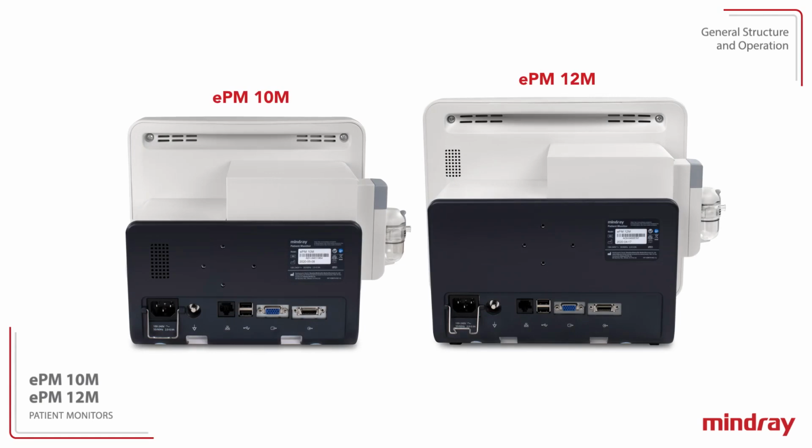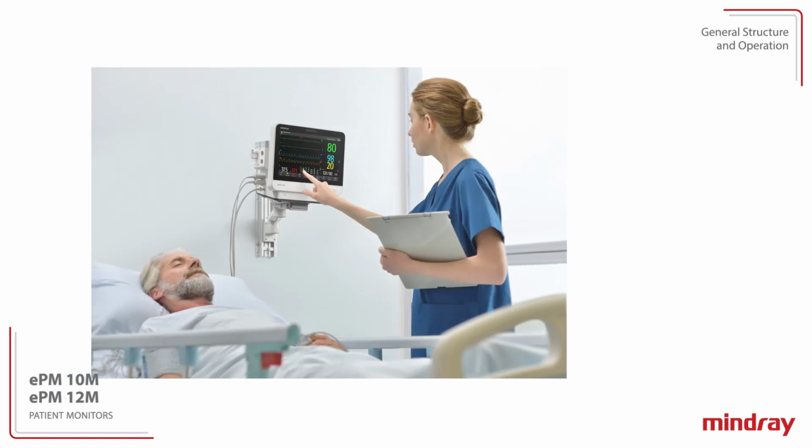The back of the ePM 10M and 12M patient monitors contains the power input and a variety of ports, including network and display connectors. Refer to the operator's manual for complete details of all connector types and functions.